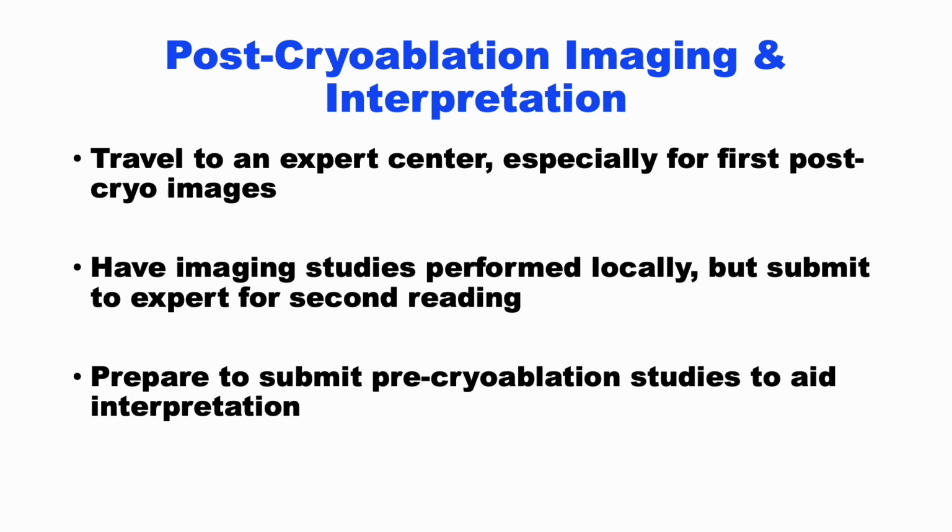Meanwhile, patients managed with cryoablation may have to travel to breast imaging centers with greater expertise in performing and interpreting post-cryoablation imaging studies, especially for the initial set of post-cryoablation studies, which are the most challenging ones to interpret. These initial studies will establish a new baseline against which subsequent imaging studies can be more easily compared.